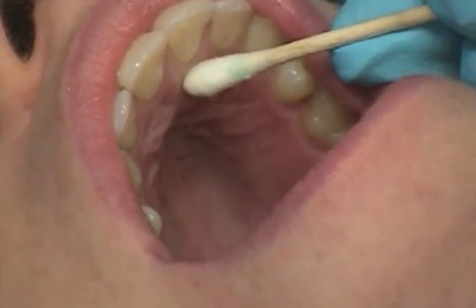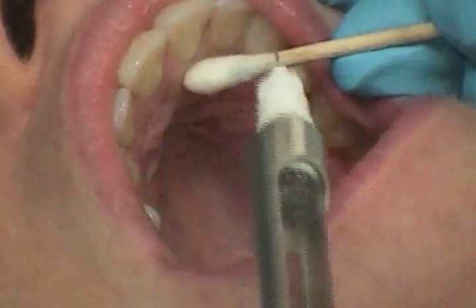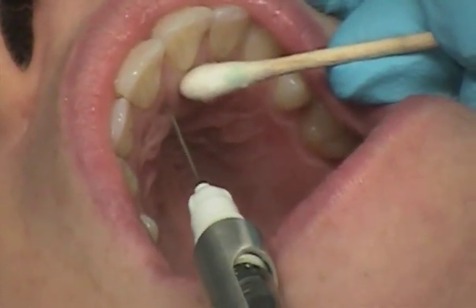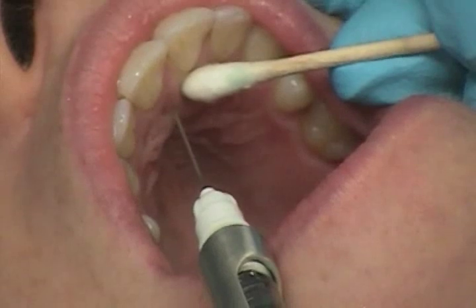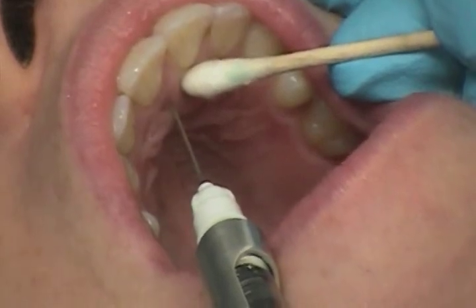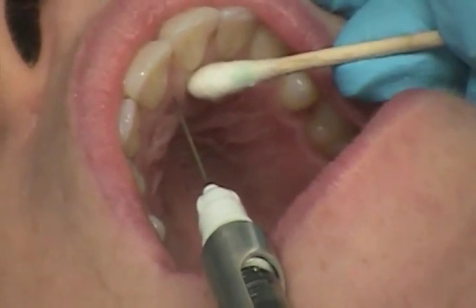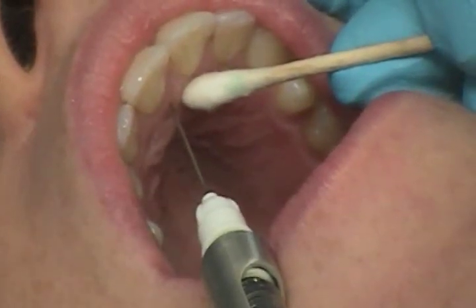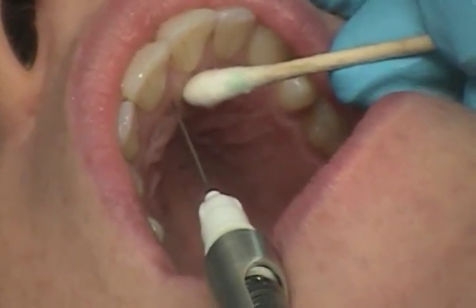The landmarks are the central incisors and the incisive papillae. The target area is the incisive foramen located beneath the incisive papillae. The needle is approached at the injection site at a 45 degree angle towards the incisive papillae, at the palatal mucosa lateral to the incisive papillae.